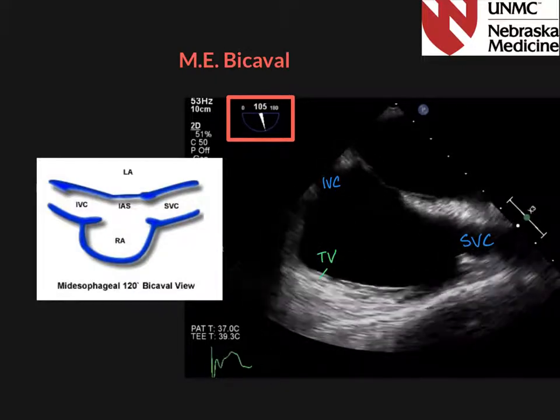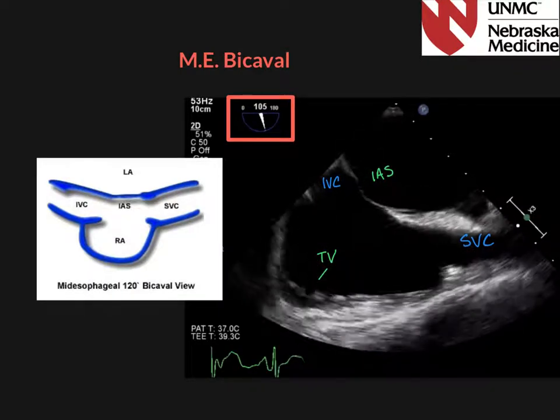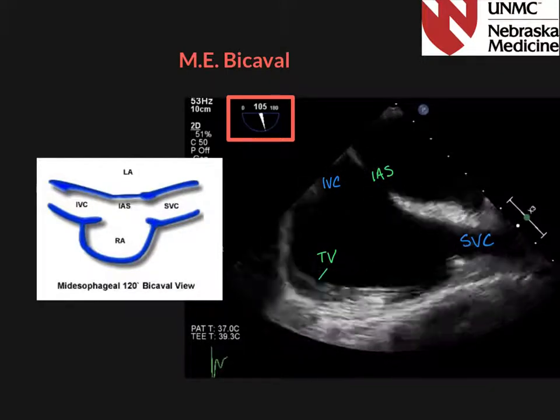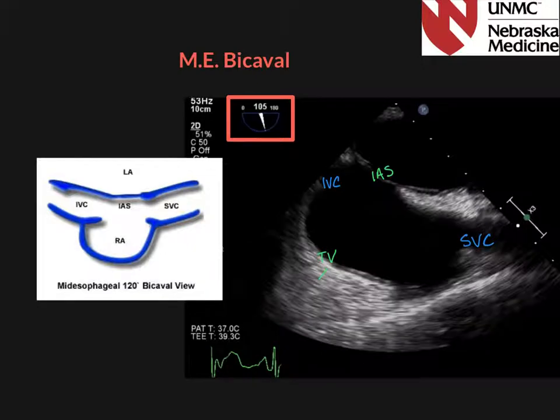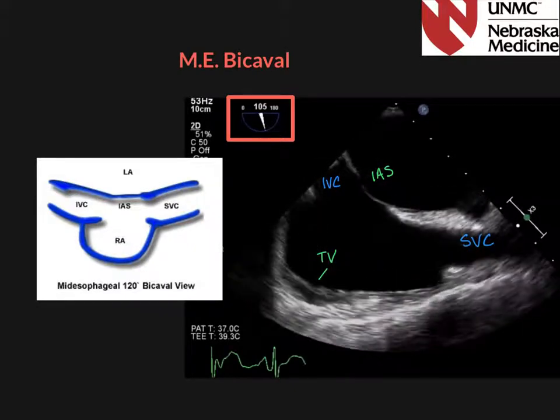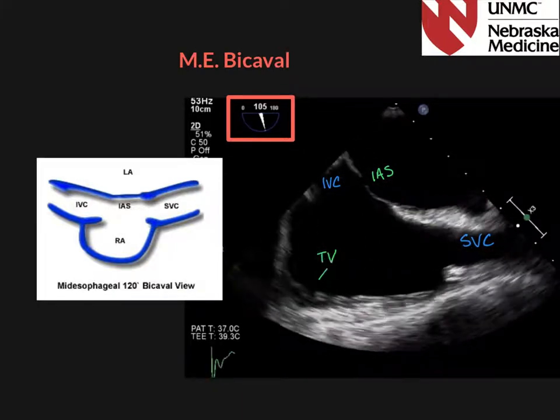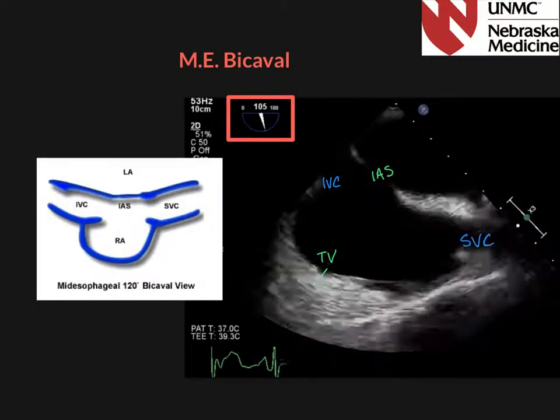In addition, interrogation of the intraatrial septum should occur in the bicaval view. To do this, remember to dial down your Nyquist scale to approximately 25 or 30 and acquire a loop displaying as thin of an intraatrial septum as possible. Further interrogation of the septum using a bubble study can also be done here as well.